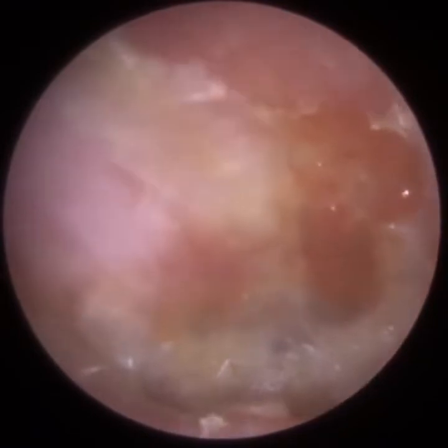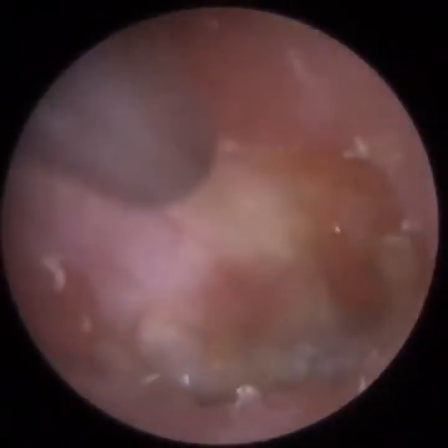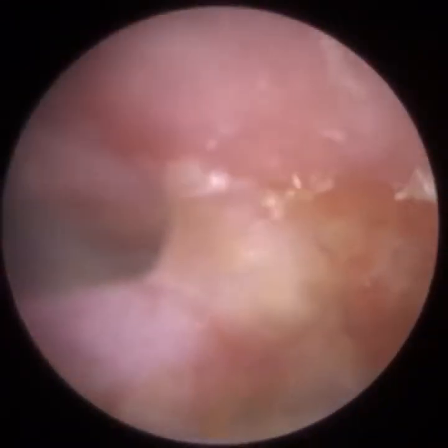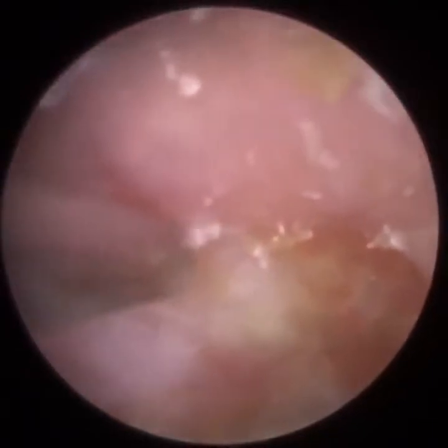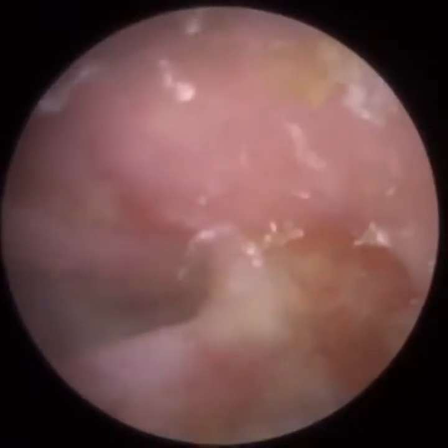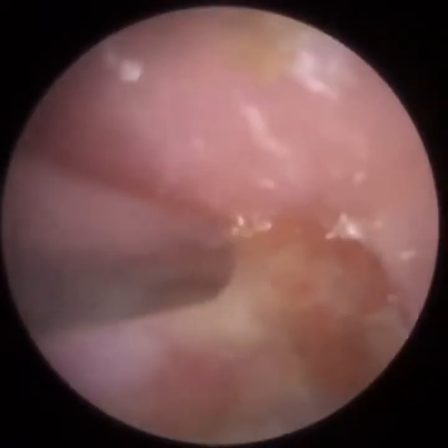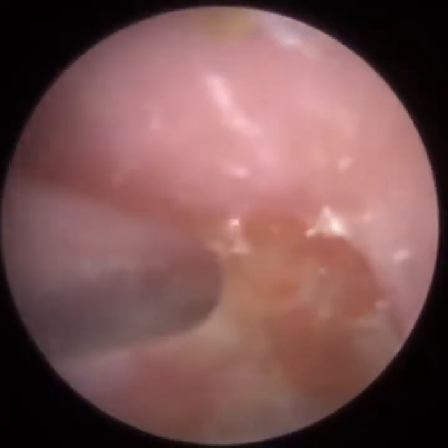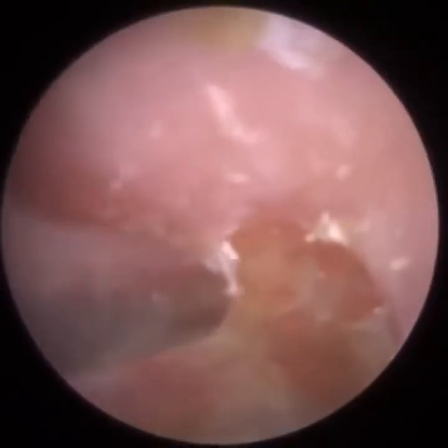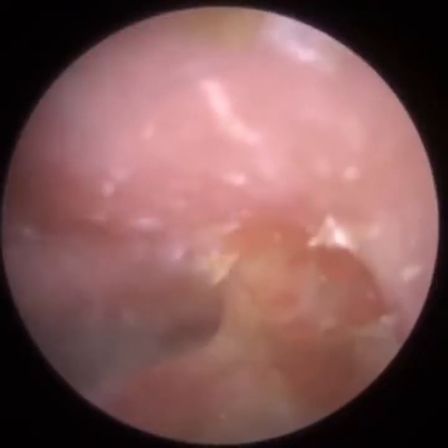It's got some dead skin, I think, at the top there. I'm going to try and peel that, I reckon. Yep, there we go. So it's going to bring this downwards. And I said it's not possible to remove all of it, but as much as I can, as safely as possible, I will. Just loosened it, I think, a bit.